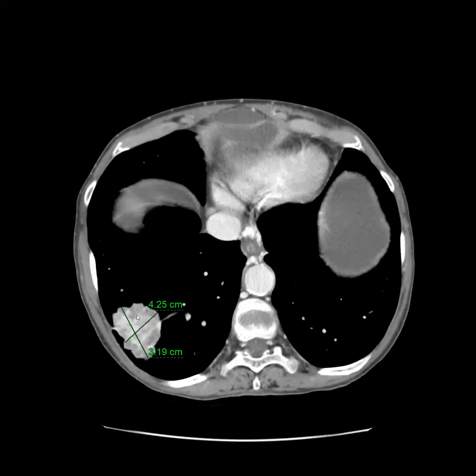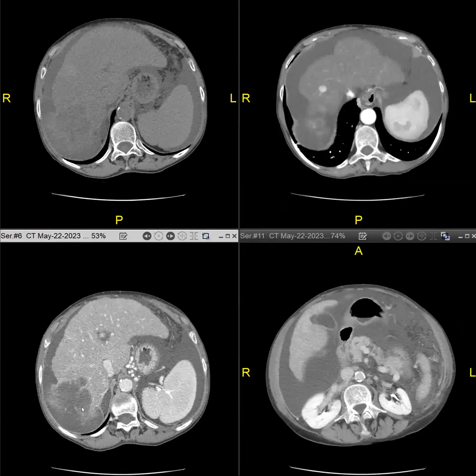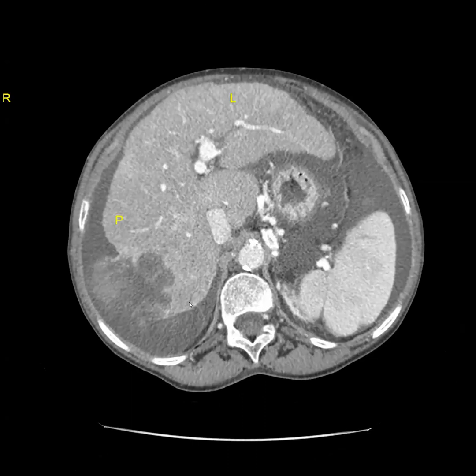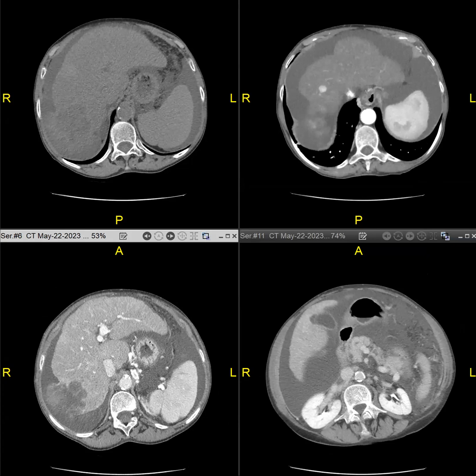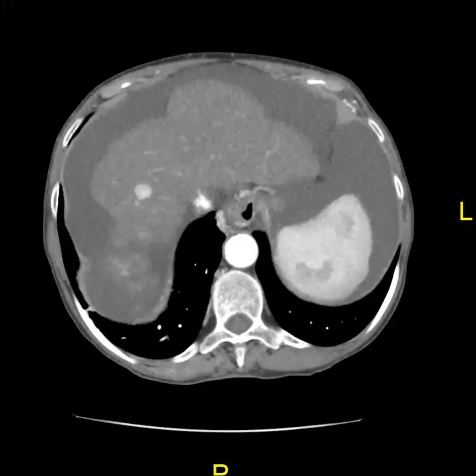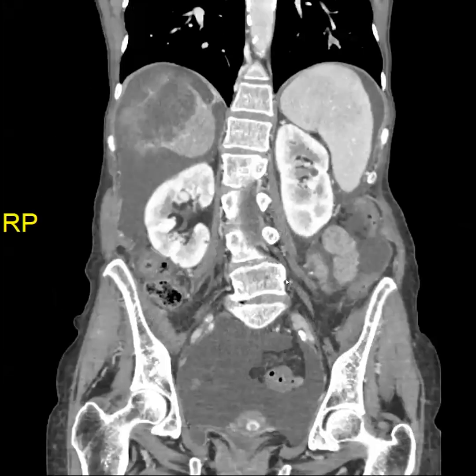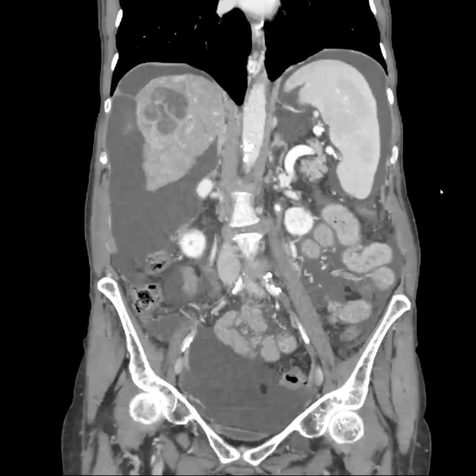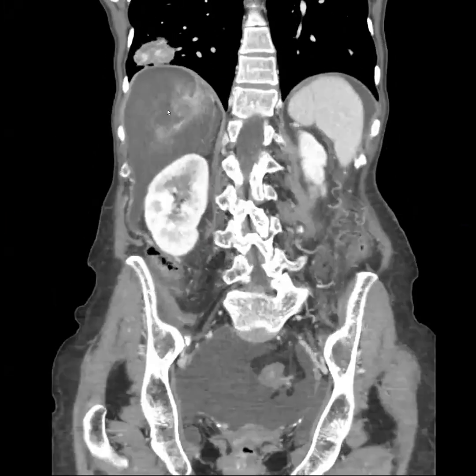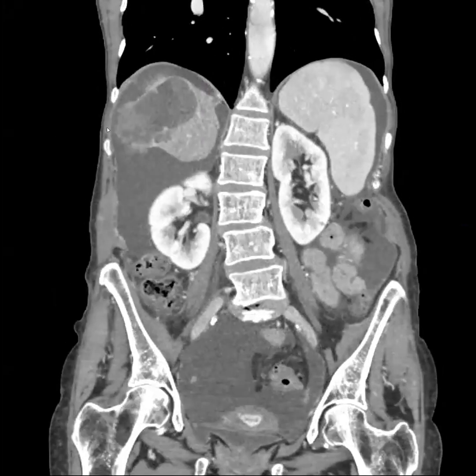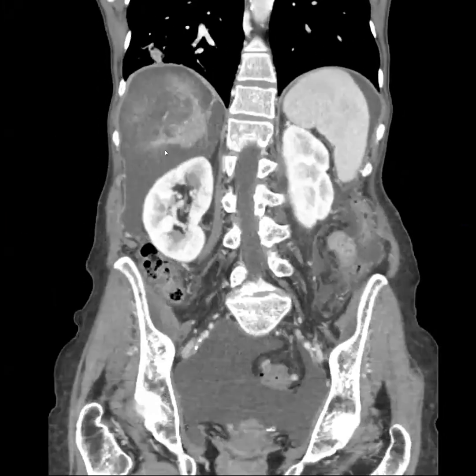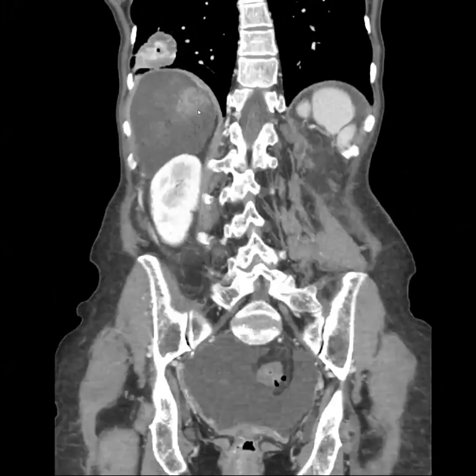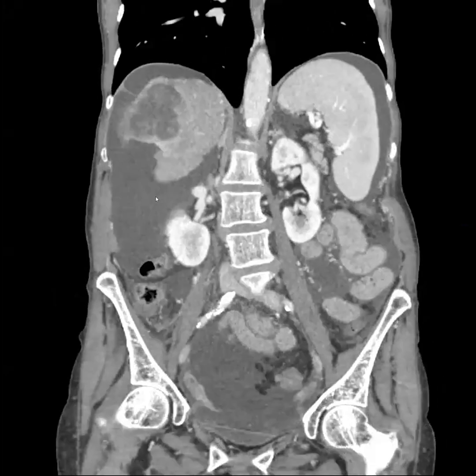You can see this mass in the right lower lobe looks like it communicates with a bronchus or is super-infected. So we thought maybe this is a met from whatever the liver thing ends up being. And on coronal imaging, you can see the tumor broke through the capsule — it's very hard to figure out where the tumor ends and where the ascites begins.